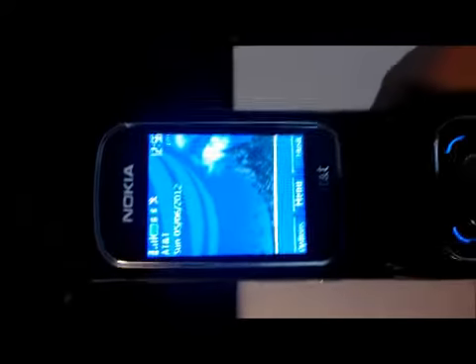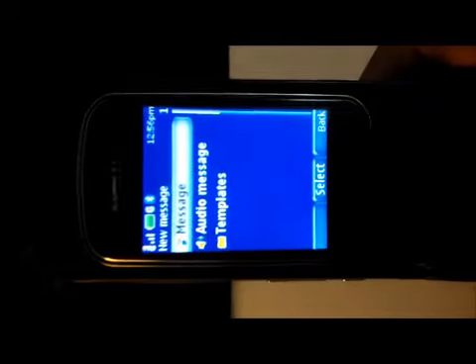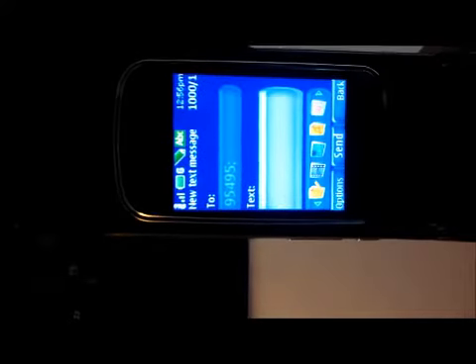The phone that I'm going to be using is this Nokia, which is a very common type of cell phone. Nokia is widely used all over, and it's very simple. I go to the menu and I go to messaging, doesn't matter what the language is, and I go to messages, and I'm texting it to right now EOS's gateway, which is 95495. That just identifies it, and it can be set up for LAU with any gateway text code.